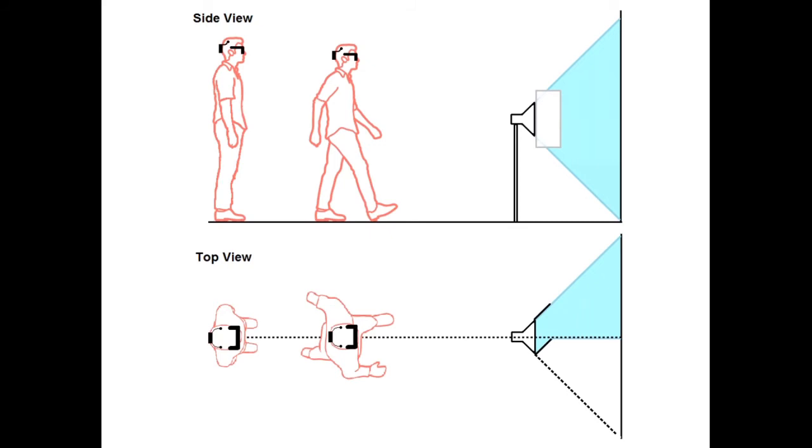So the idea is that we can average enough of these trials, enough individual flickers of the 10 Hertz flicker, such that any movement artifact will be averaged to zero and be comparable to the SSVEPs while standing. The first thing we need to do is establish that this is the case. We need to know how many segments we need to average away this noise.